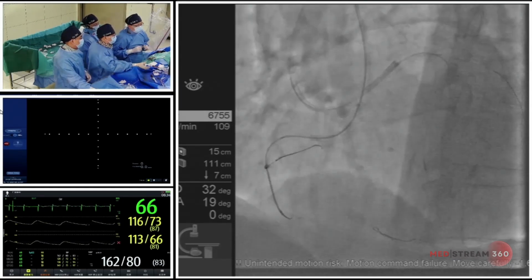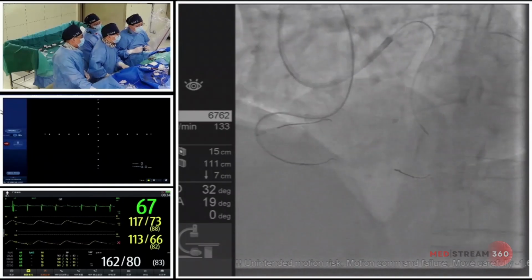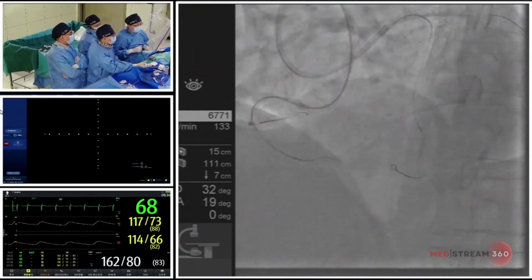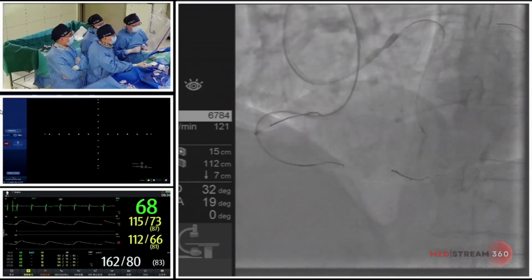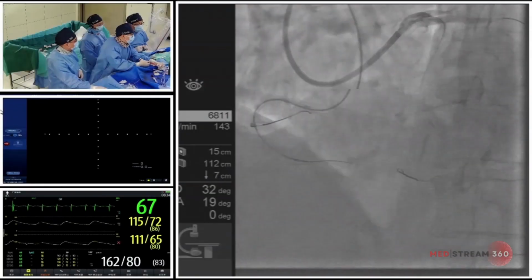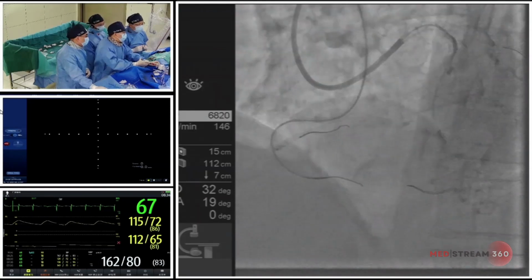Maybe this is one of the choices, but this is a little bit risky because the septal damage may cause some contrast residue and a little bit of perforation. But this is, I think, a technique that we can try from the retrograde. Traverse the cap. The fibrous cap is relatively softer compared to the antegrade fibrous cap.